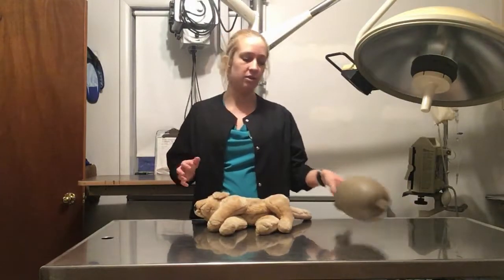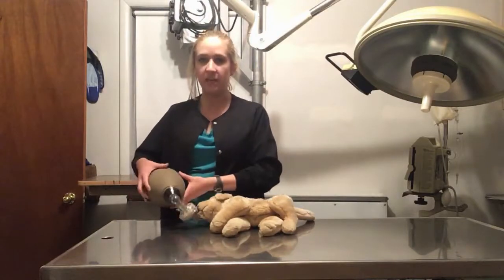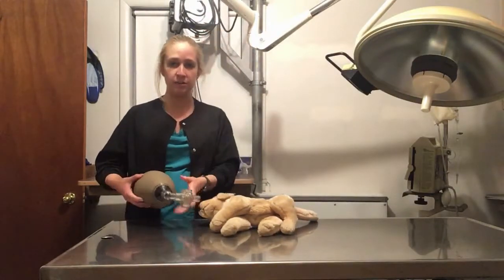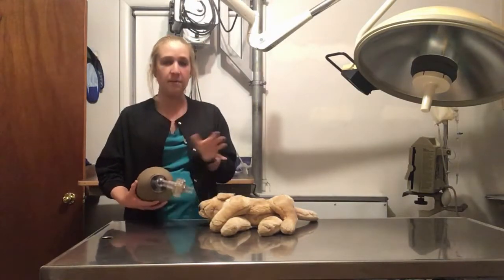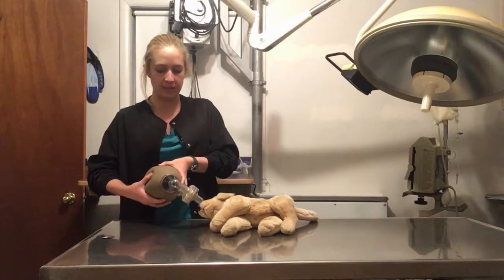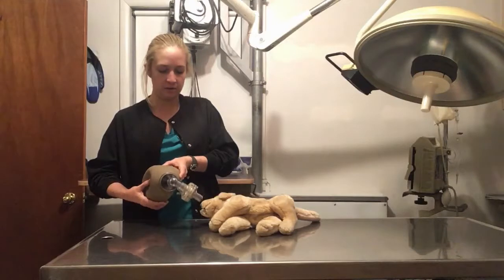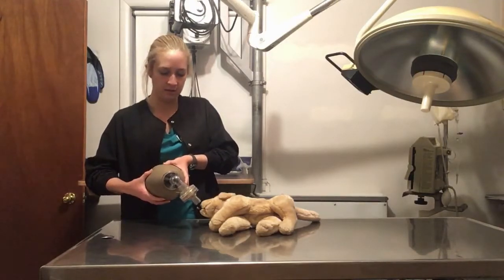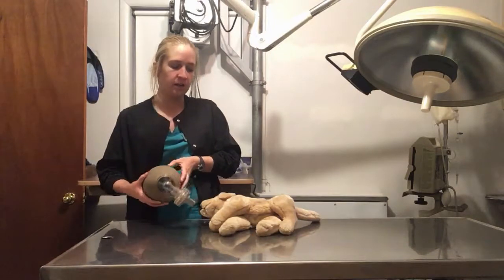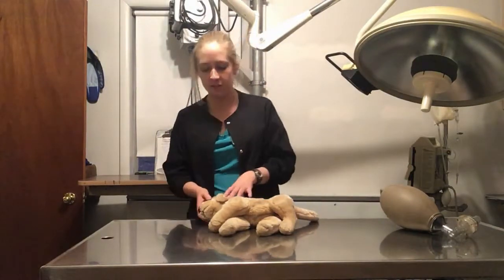If a dog is already intubated or it's possible for you to intubate the dog, you're going to be using the ambu bag. You're just going to attach it onto the end of the endotracheal tube, and you're going to make sure to go very slowly, about 10 breaths per minute, and just squeeze, release, squeeze, release, squeeze, release, squeeze, release.